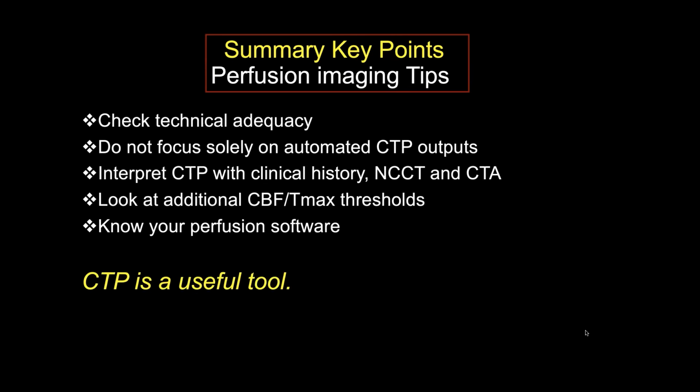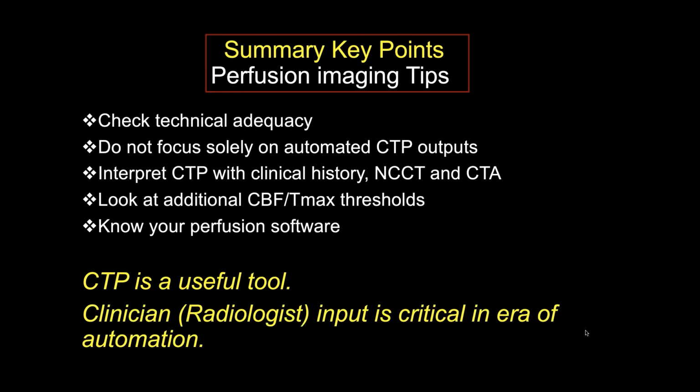For all the pitfalls and the pearls that I talked about, I do want to say one thing. CTP is a useful tool. It can definitely give you useful information in the code stroke to make these important decisions. But in the era of automation, when you get this map on your phone on a single simple click, I think it's all the more reason that there is human interaction. The clinician and your radiologist's input is going to be critical in the era of automation.